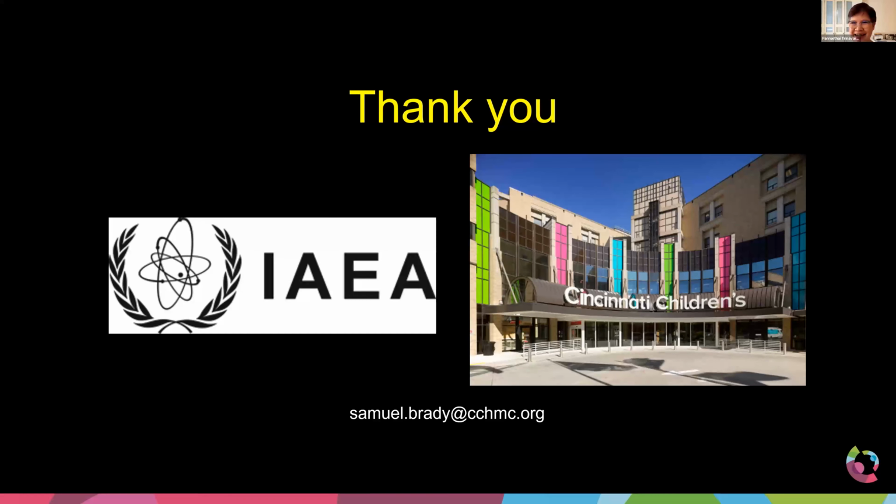Yeah. And so that is the question that we've been trying to answer here in the US and in Europe too, all around the world: is there a reason to do dual energy in children? 5 to 10 years ago, the answer was no, because the dose was much higher. It's 2, sometimes 3 times as high as the single energy CT. And so no one really looked at it. But now, as you mentioned, the doses are about the same, especially for the larger kids.